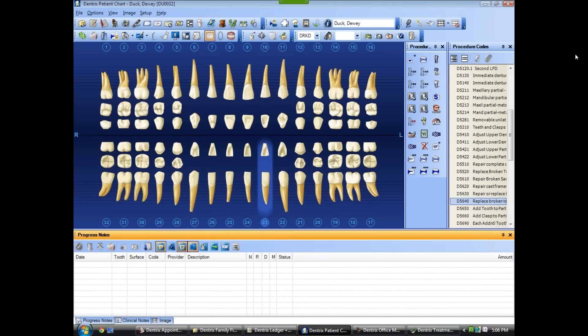Linda and I are going to do some charting on a new patient. The first thing we're going to do is put in the missing teeth. The first thing I'm going to do is turn on the sticky switch — this one over here.